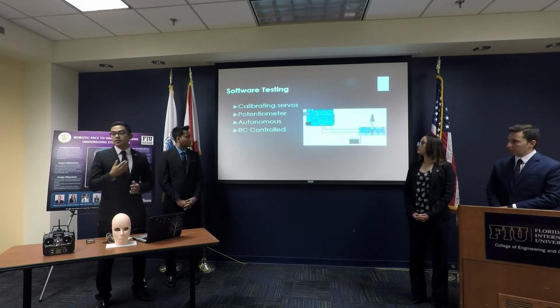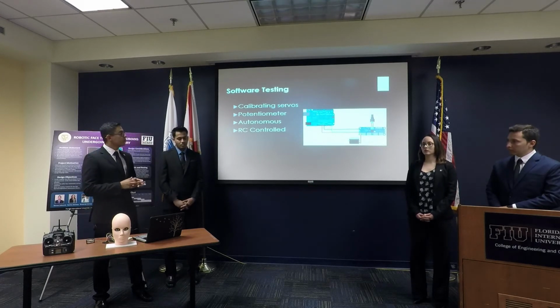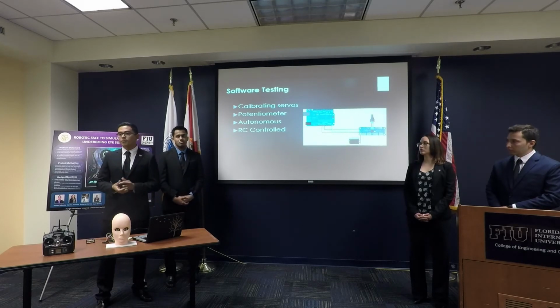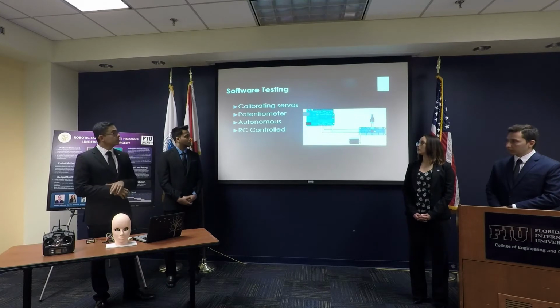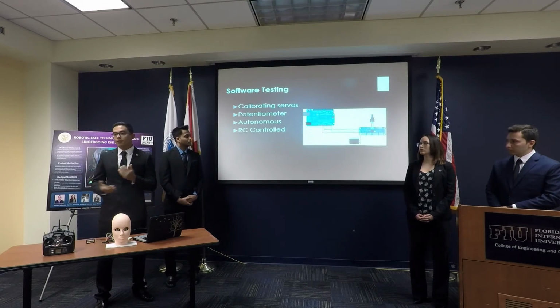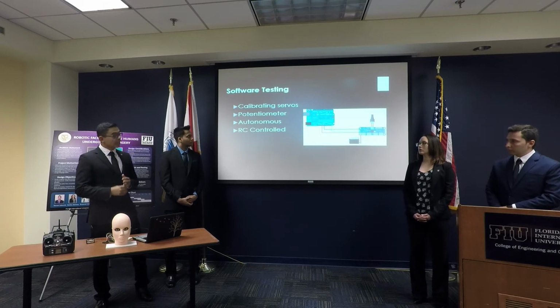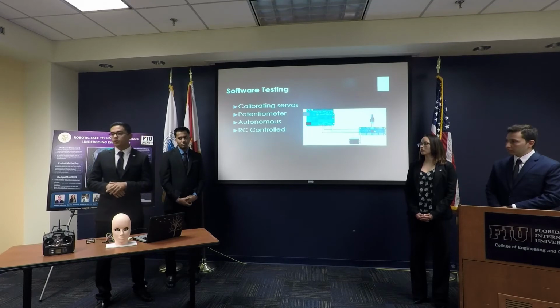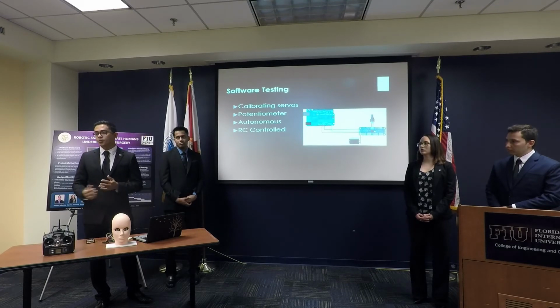Later on, as Steven said earlier in the presentation, we created an autonomous code, which is no more than random movement for the eyeballs. All this was done using Arduino, which is open source, so it's available for everyone. And later on, our final prototype is controlled thanks to RC control, and this one was also done using Arduino.